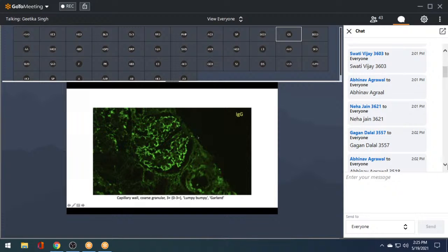But of course, would it only be IgG on the panel? No. When I look at my whole panel, I will see that I also have C3 there, right? Because there's definite complement activation happening in a PSGN, and I will see those deposits. I will also have kappa and lambda, because heavy chains are not going to come alone. The IgG will be IgG kappa and IgG lambda. So that's how my panel would look. Whenever you look at your textbooks, it's telling you the most important antibody there.